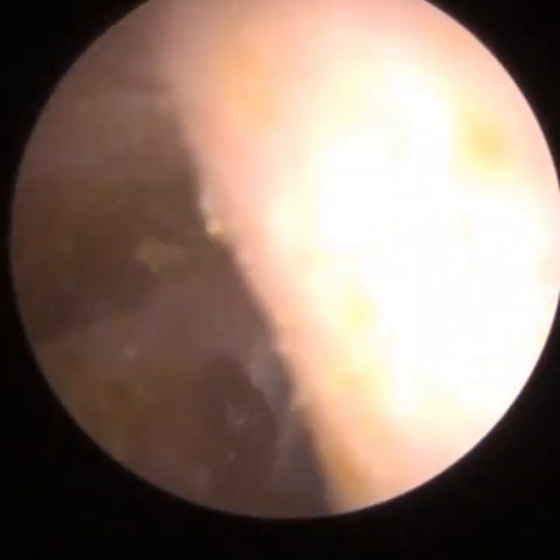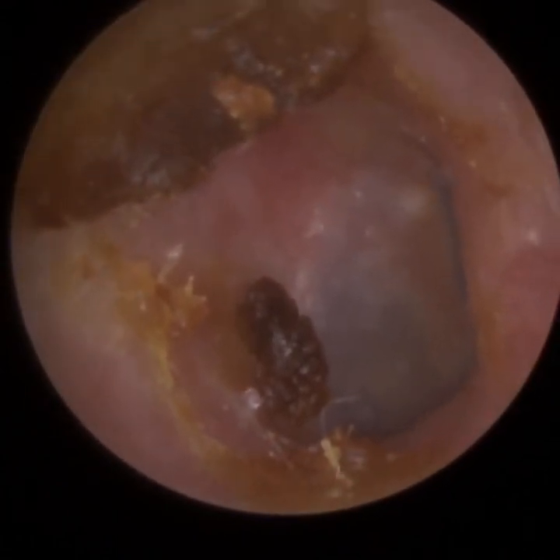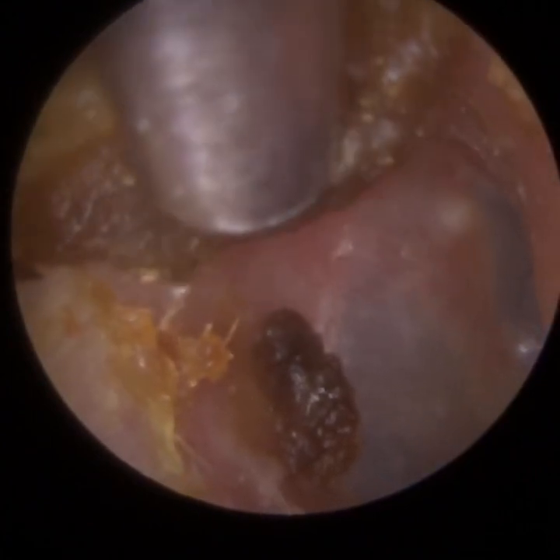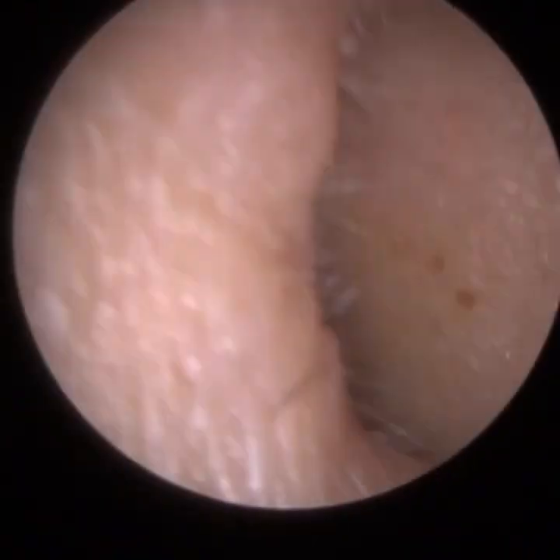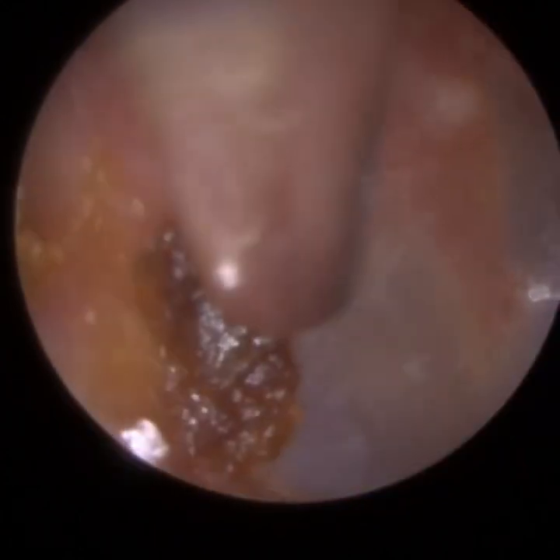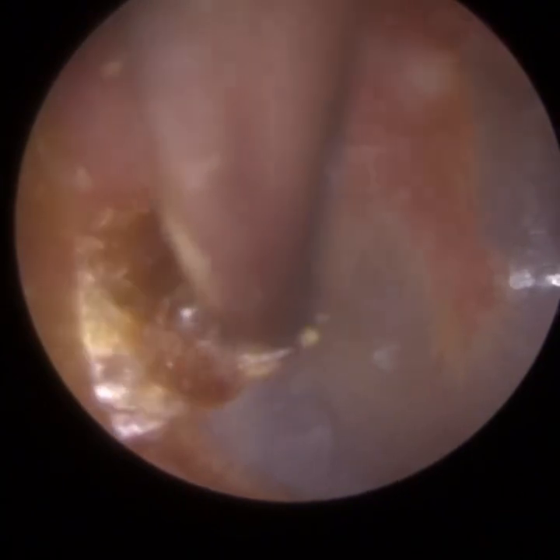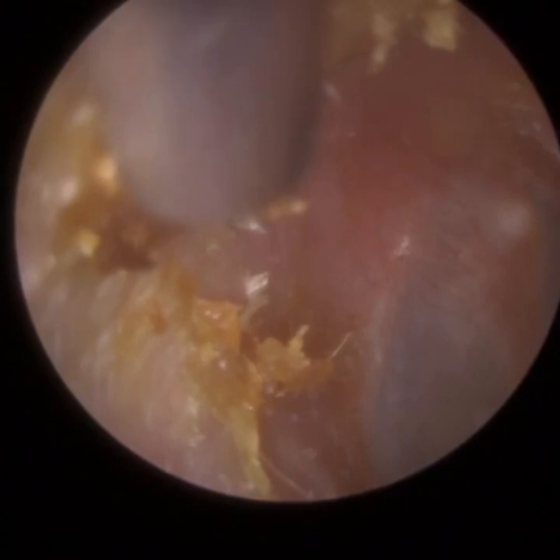So I'm now just removing wax off the patient's eardrum. You can see it's the eardrum — the distance is now visible. There's just some soft wax and keratin around the edge, the perimeter of the canal wall. The patient doesn't typically suffer from ear wax, so I was quite surprised. This wax was originally just coating the canal wall — it wasn't occluding in any way. When you graze it, this surface wax collects into larger pieces of wax which then become visible.